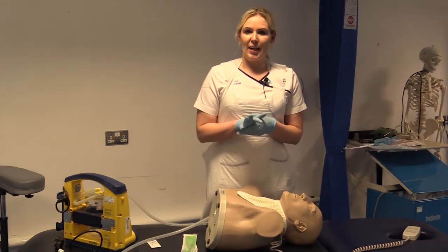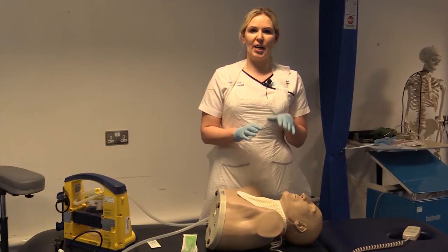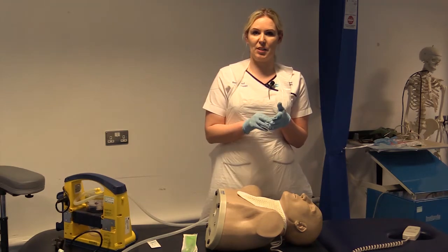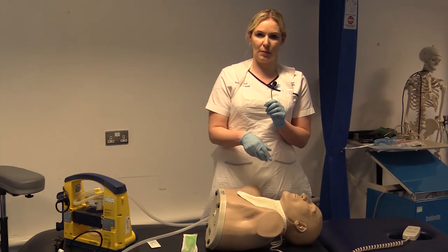Okay, so in this video we're looking at Yankauer suction, which is a lot more straightforward, but the same principles still apply, and we're going to use Yankauer suction to clear visible secretions from the mouth. You're going to obtain informed consent where possible, and you're going to check the patient's medical notes. You're going to wash your hands and put on your appropriate PPE before coming to the patient.